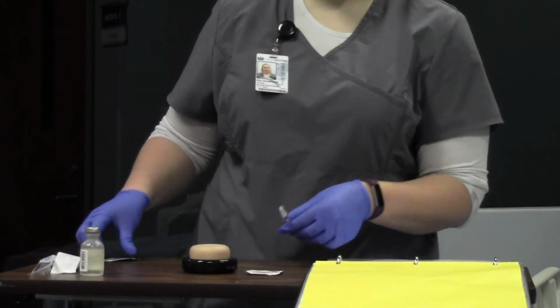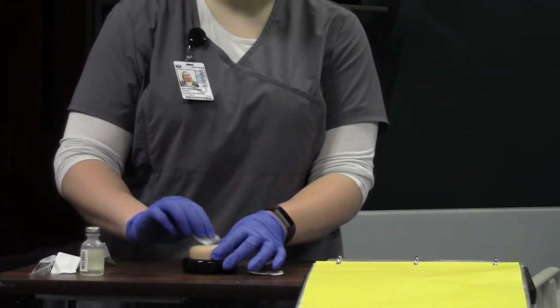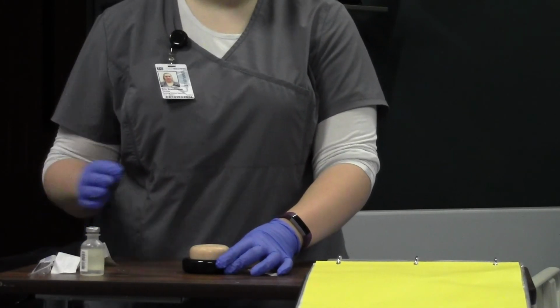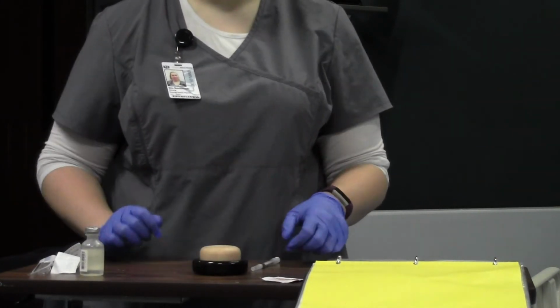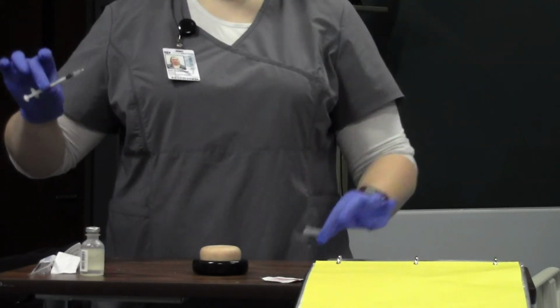So when I get ready to insert, I'm going to clean my patient's skin, starting as a circle and going out, letting the skin dry. Don't wave over it or blow on it. That's just going to put germs back on the skin and compromise your patient for infection. Once the skin is dry, again, I'm going to uncap my needle.